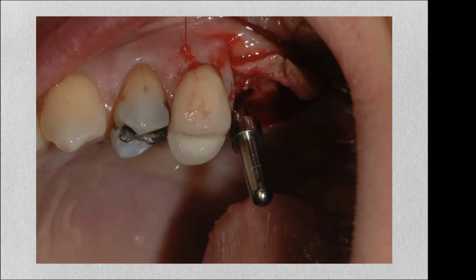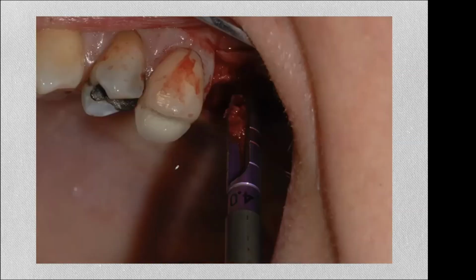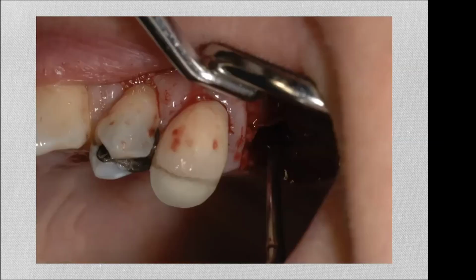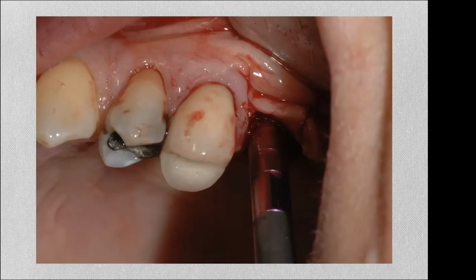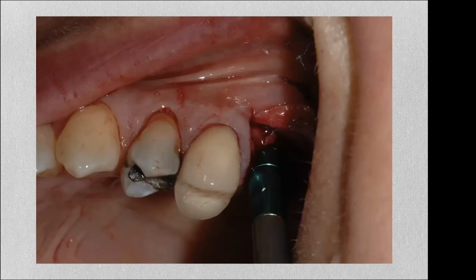Okay. Now, the thing is, I know that the osteotomy is going to be very deep on the very mesial end of it, but very shallow on the very distal end of it. Okay. So we place the implant after a series of reamers going all the way up to 5 millimeters. Okay. And then check the integrity of the walls and the floor. Okay. And we fracture the floor using this osteotome. And so it's then fractured.